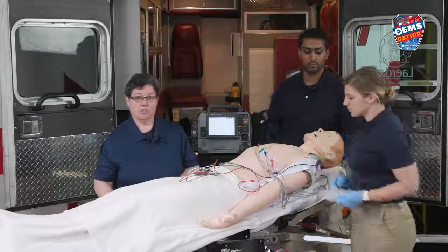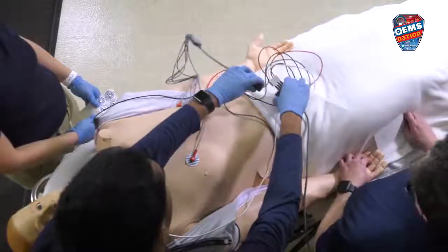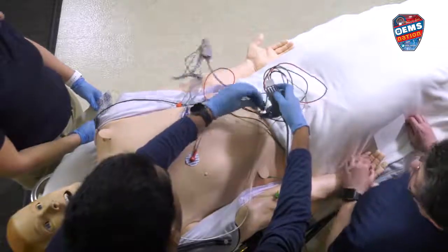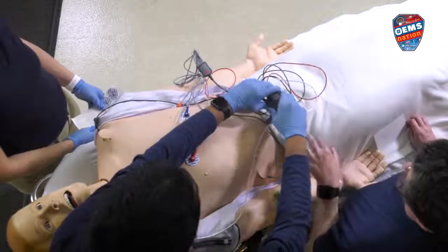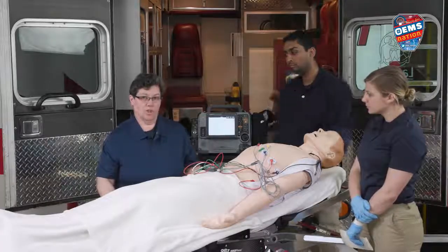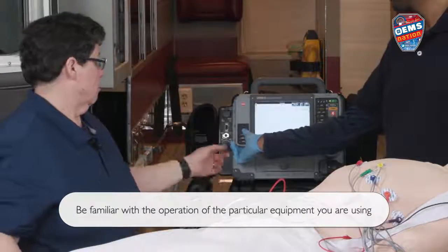You want to make sure that the chest is dry so that the electrodes stick well. If there's excessive hair, you want to shave that so you can get a good reading. Then you're going to plug in your cables to the rest of your four leads, and on your monitor — there are several different types available — you're going to push the 12-lead button.